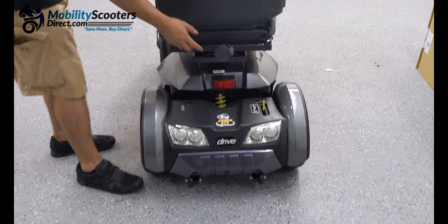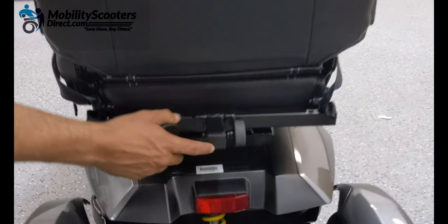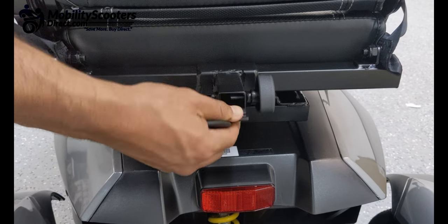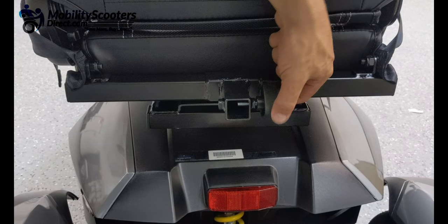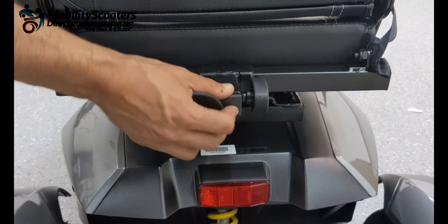Towards the rear we also have a universal one inch hitch adapter which can be used to install a rear basket, oxygen tank holder, cane holder, quad cane holder, and various other types of accessories.